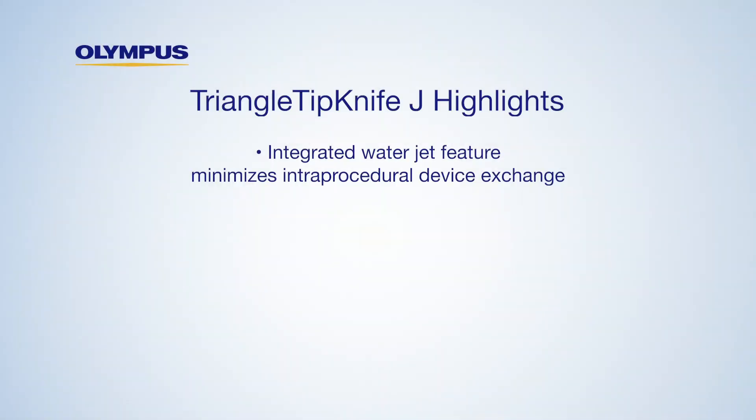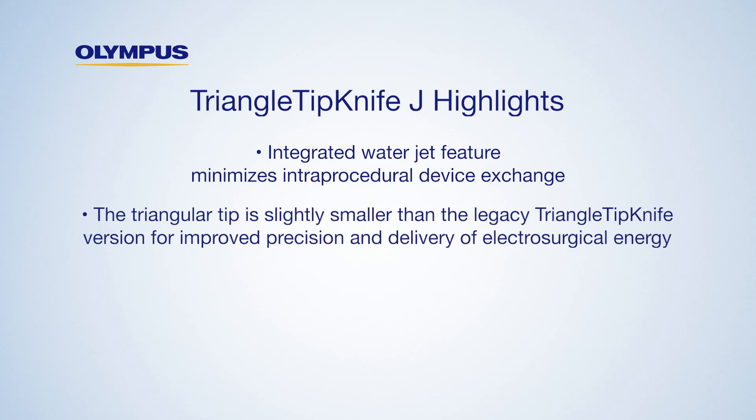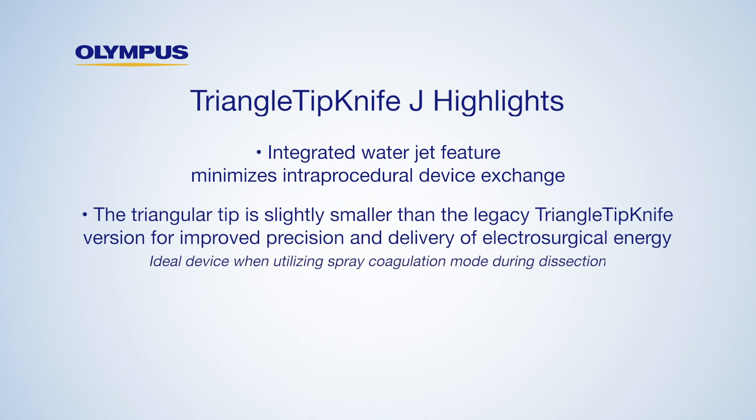In summary, the triangle tip knife J has an integrated water jet feature that minimizes intra-procedural device exchange. The triangular tip is slightly smaller than the legacy triangle tip knife version for improved precision and delivery of electrosurgical energy. This is the ideal device when utilizing spray coagulation mode during dissection.